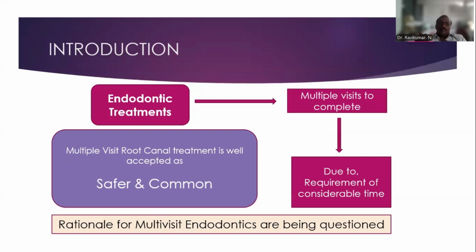What are the endodontic instruments? In olden days we used a micromotor to do the access cavity. Then they introduced the aerotor with a speed of 3 lakh RPM, which removes the debris within a moment. Once that is removed, with the help of the pathfinder you locate the canal, or with the help of the GG, remove the shoulder and enlarge the orifice of the canal. Once you enlarge the orifice, introduce the pathfinder to check the patency of the canal.